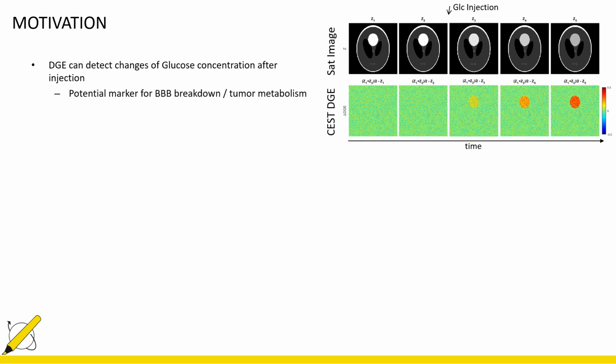contrast. Now, the whole method forms a potential marker for blood-brain barrier breakdown or maybe even tumor metabolism, and so far it was mainly shown at ultra-high field. However, it would be pretty convenient to also have the protocol on a clinical field strength so that we can run larger patient studies. And when we want to do that, we are facing several problems.